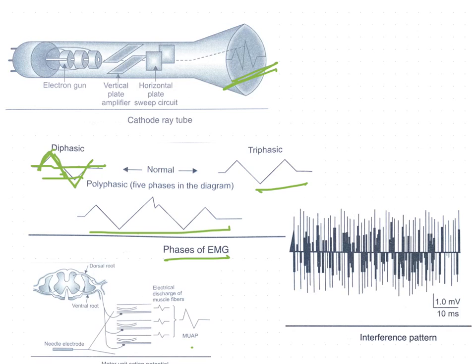The muscle fibers of a single motor unit are sometimes intermingled in a muscle, and they are distributed in time and space. Because of these temporal and spatial properties, the motor unit action potential recorded in the needle examination is a summated action of all potentials of various muscle fibers of the particular unit.